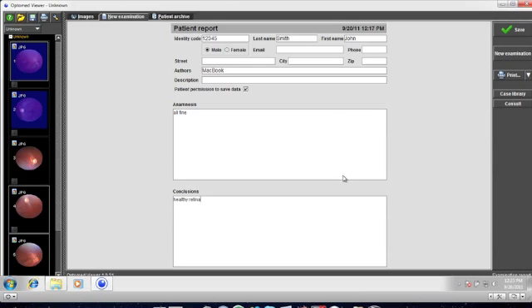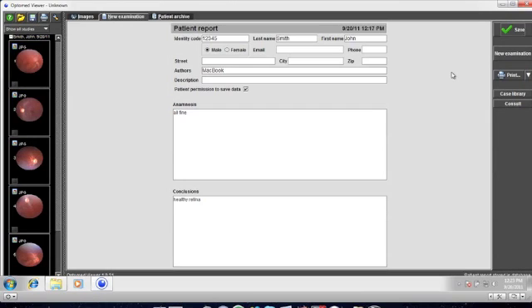Then click on the save button on the right hand side. Below the save button, there is also the option to print out the images and the report.